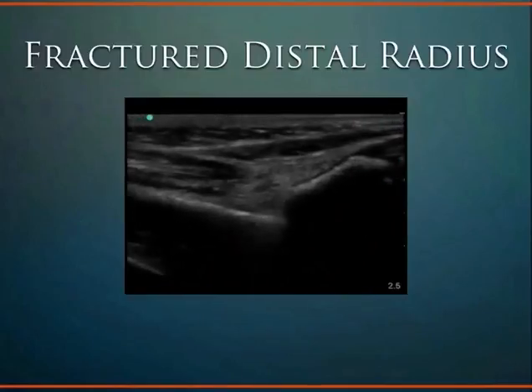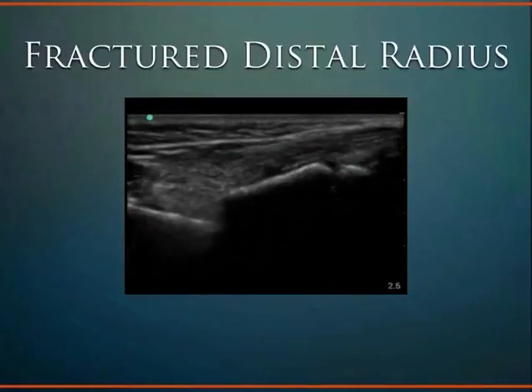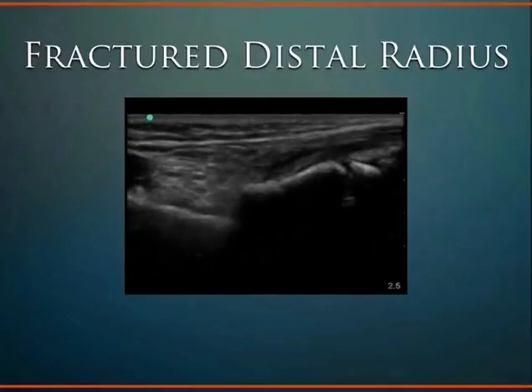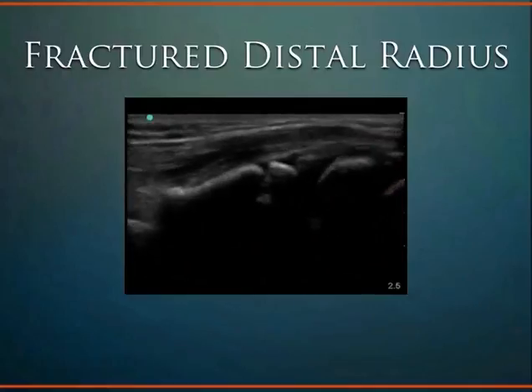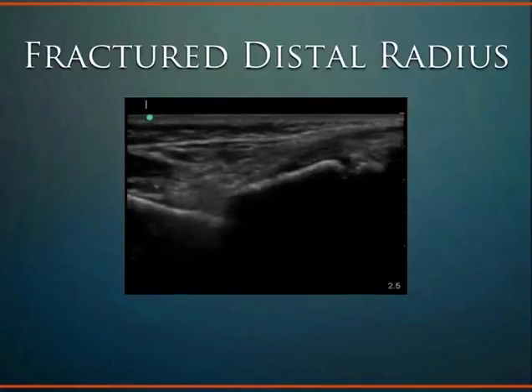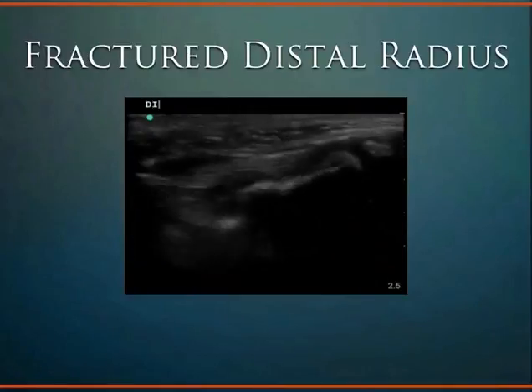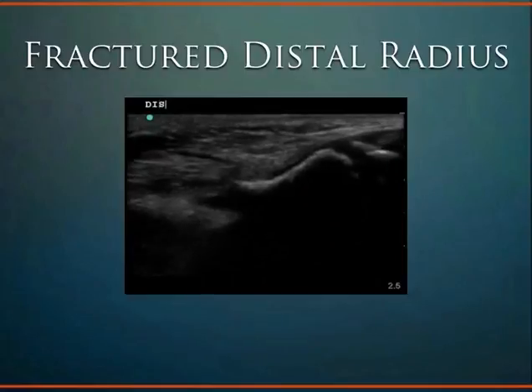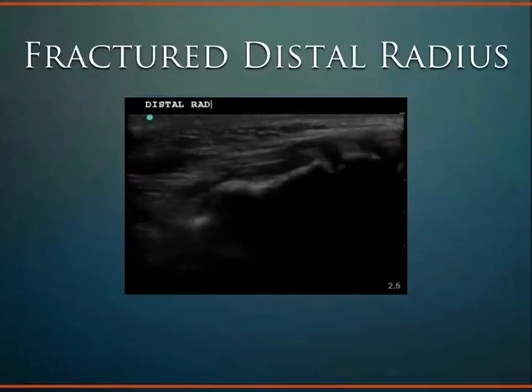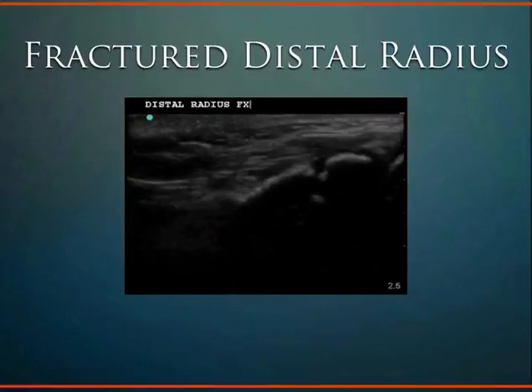Is it really painful for the patient to ultrasound a bone fracture? Not so much, and you actually use the site of maximal tenderness as a guide to where to image on the bone as your protocol to find it. With different regions of the body, you do have to put a little pressure. But most of the time, especially with these forearm bones or bones that you're typically going to image for fracture visualization, you don't really have to push that hard.